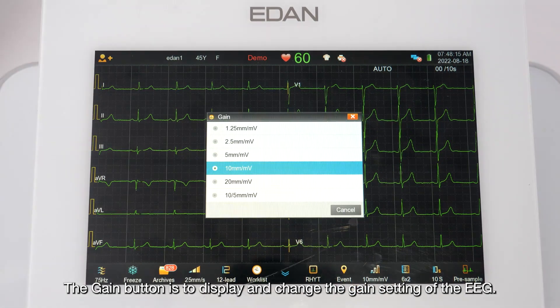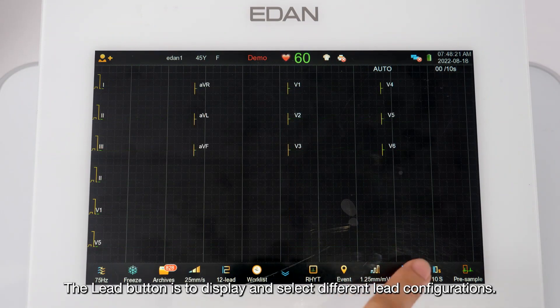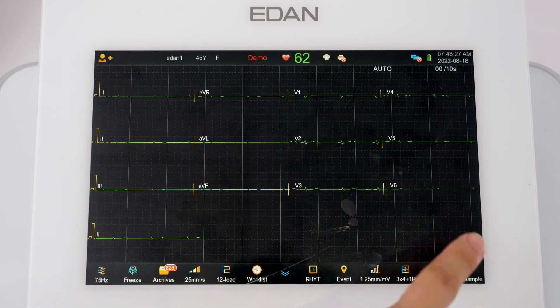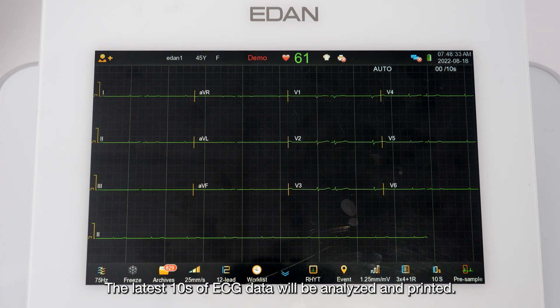The Gain button displays and changes the gain setting of the ECG. The Lead button displays and selects different lead configurations. Tap the Pre-sample button to acquire ECG data as soon as the ECG cables are connected to a patient; the latest 10 seconds of ECG data will be analyzed and printed.